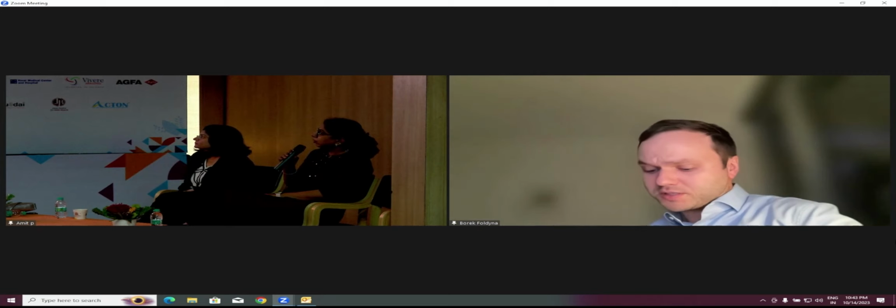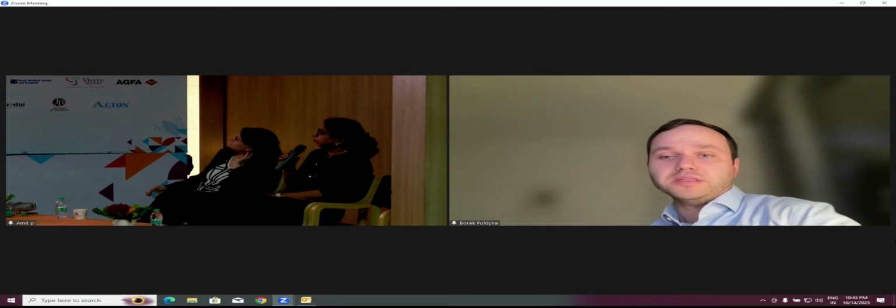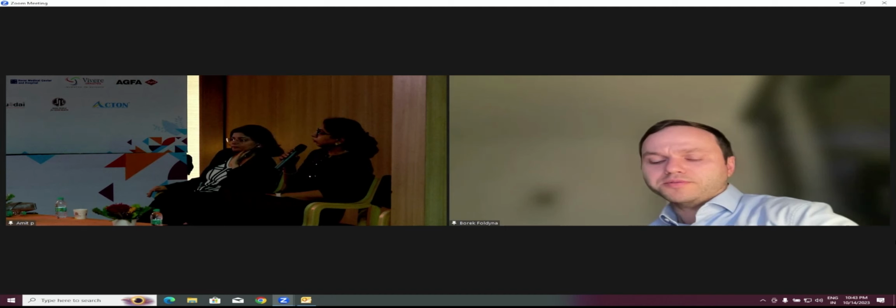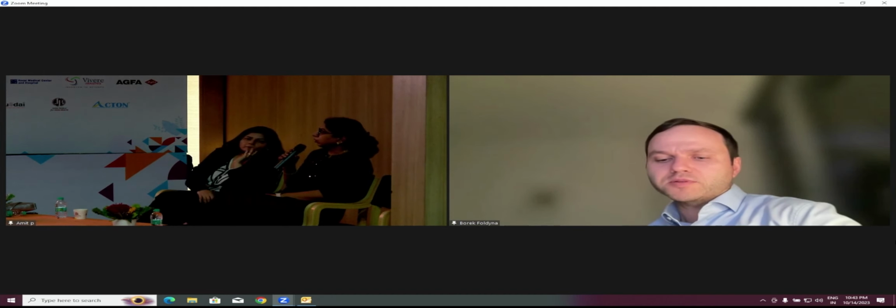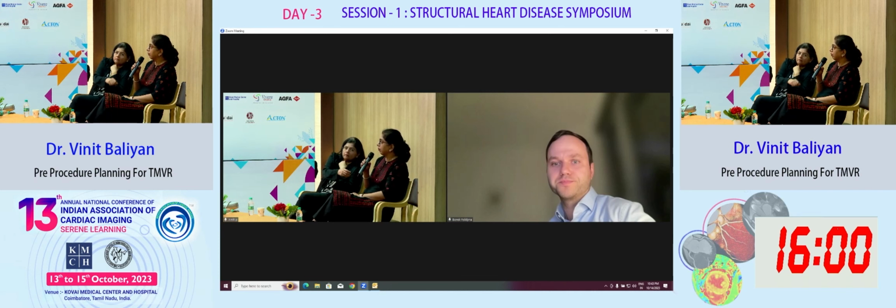Well, the deficiency is usually 5 millimeters, but as mentioned, there are few vendors that are actually making custom-made occluders, so they can kind of compensate for it. But we usually look for everything less than 5 millimeters. Okay. And there are a few studies actually showing that not only the size, the length of the rim, is important, but also the thickness, right? So it's not the length only. Even if you have a long rim which is very thin, it doesn't warrant that your device is going to be stable and anchored. Okay.